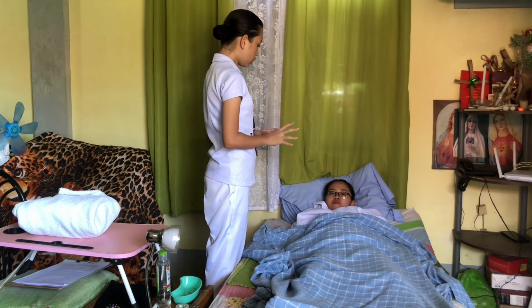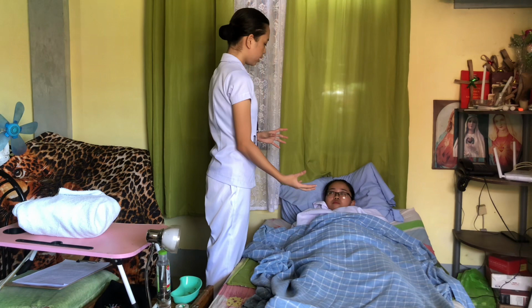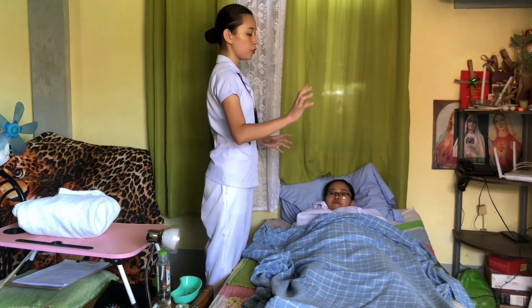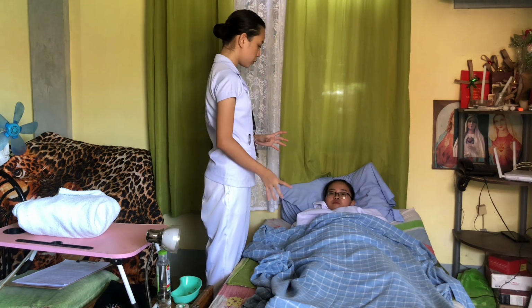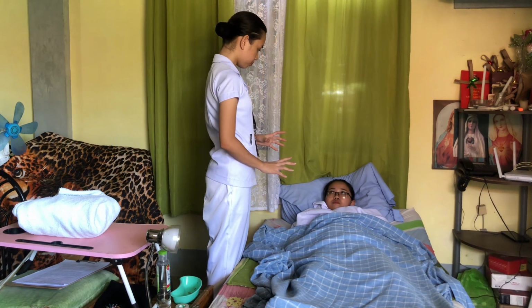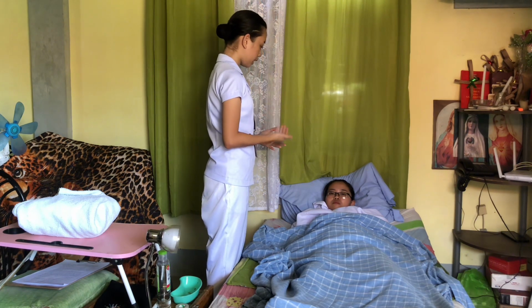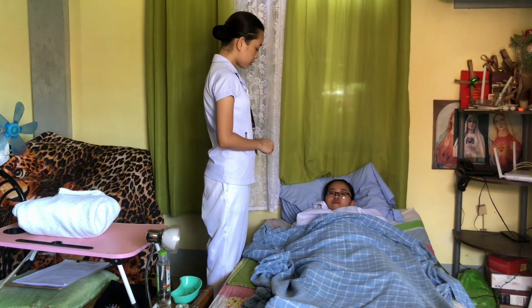Okay, so later on in the procedure, I am going to expose your genital area, ma'am, and you might feel a little uncomfortable, but you don't have to worry because I am only going to expose the area that will be part of the procedure. The rest will remain covered. Okay? If you feel uncomfortable or uneasiness, feel free to tell me. Okay po? Okay. Do you have any questions regarding the procedure before we proceed?